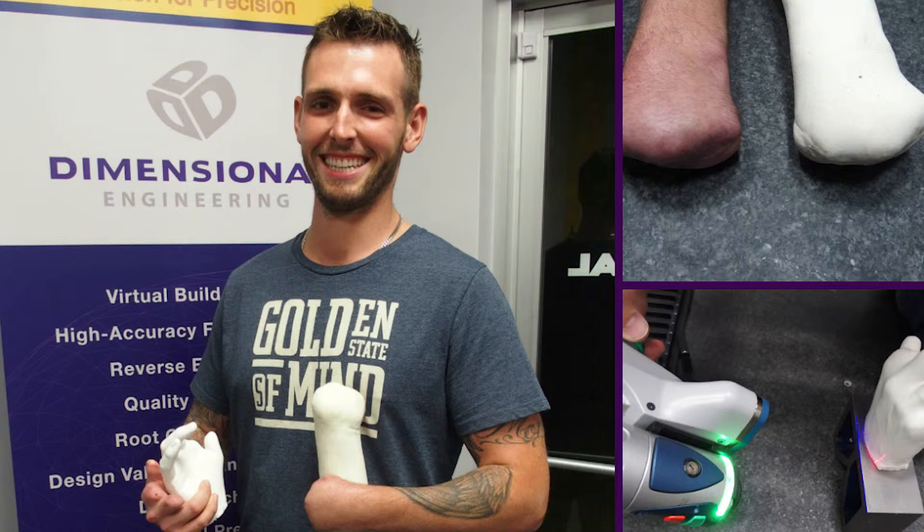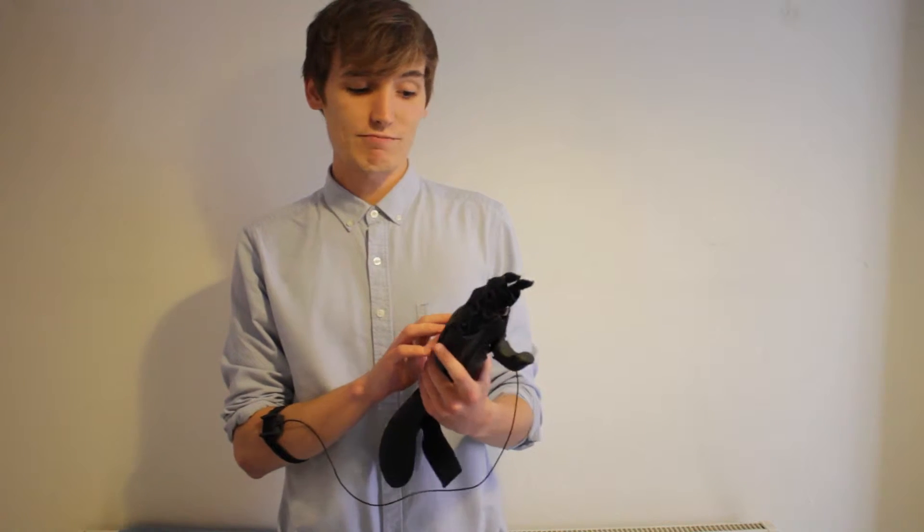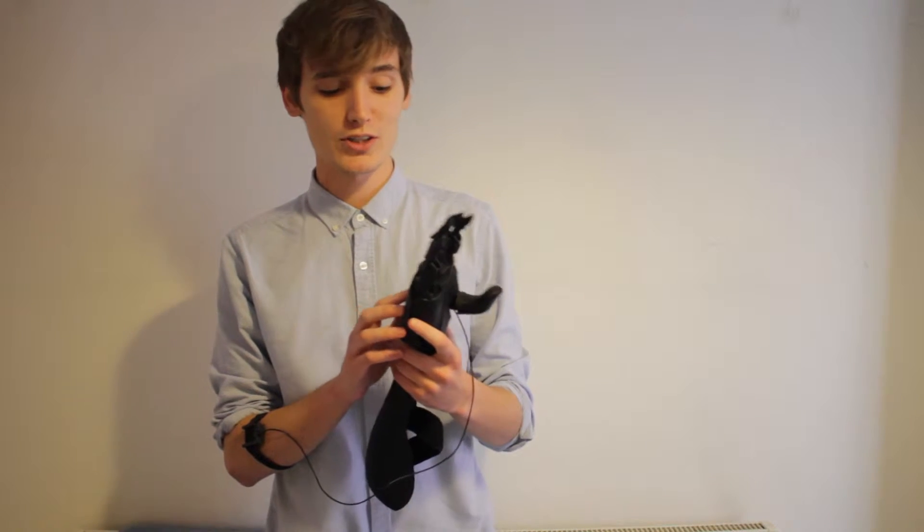Ryan recently got his 3D scans done by Dimensional Engineering. A really awesome guy called Jason Arself sorted it all out with Re3D and one of their friends. And we'll give you a demonstration of the Hackberry.